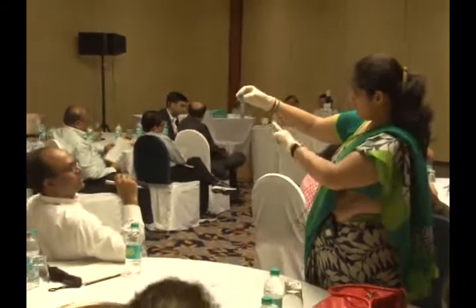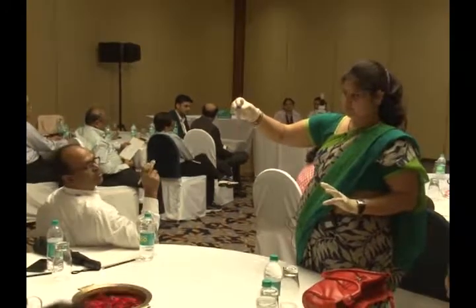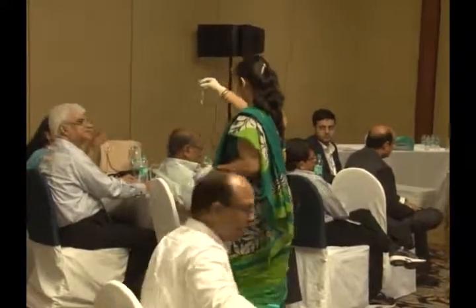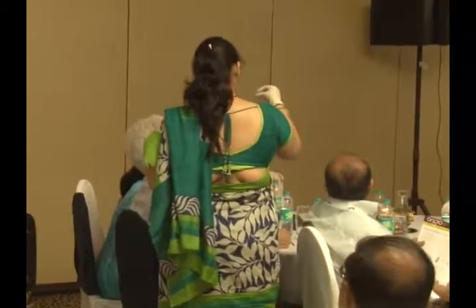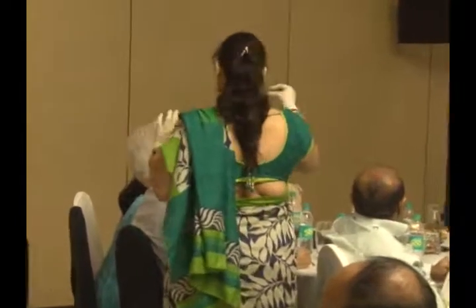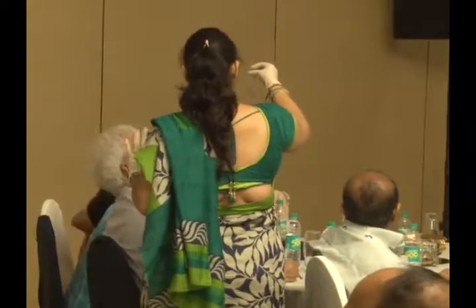Yes, this is 2 ml. See now, this is higher, lower. Higher will come down. But anyway, we can interchange. The main thing is the interface has to get created. All the 3 layers should be seen properly.